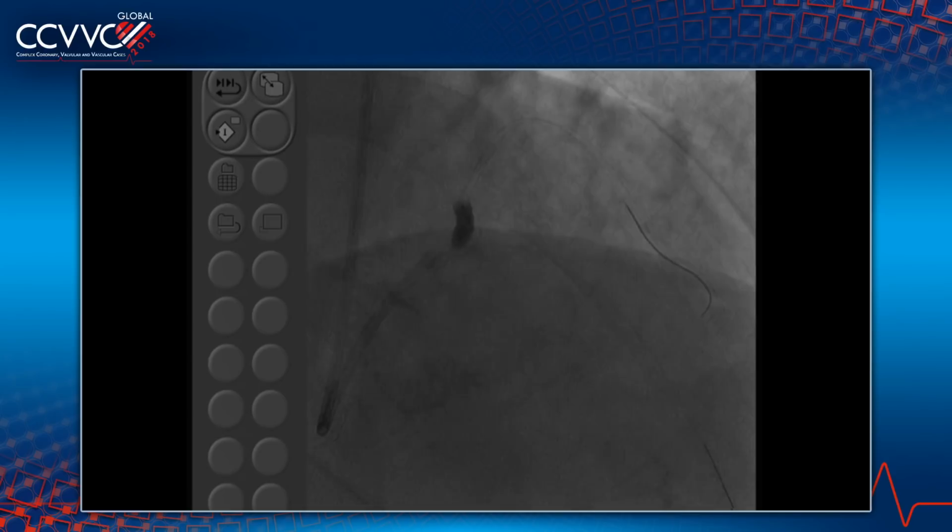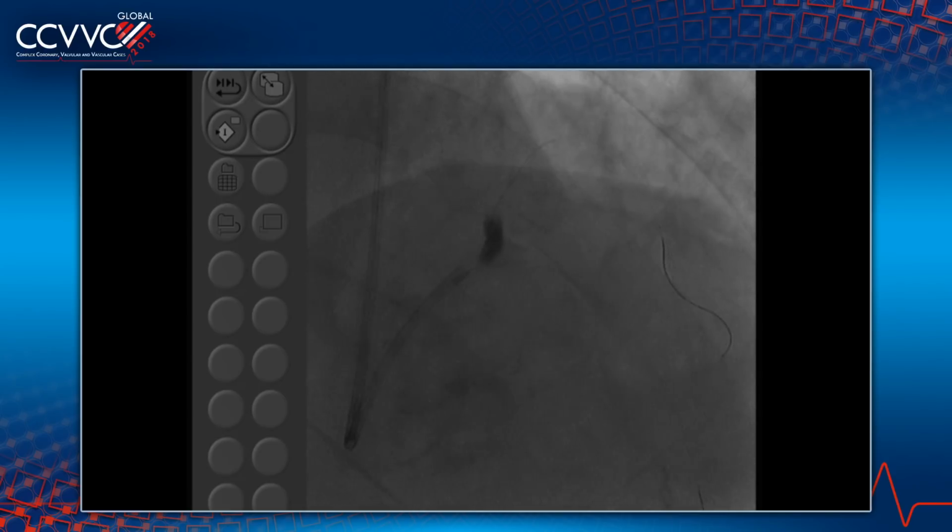We're not tuned too much to seeing the difference between like a 4, 4.5, and 5. It'd be always grossly undersized. When you place 2 stents, especially in the left main, you should do a final IVUS. Dr. Sharma, did you hear that? What do you think about that? Are you planning for the symposium only? Symposium only.